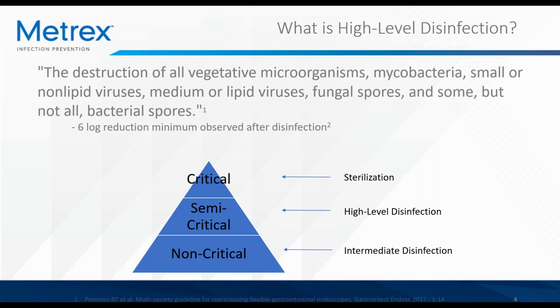The focus of today's webinar is high-level disinfection, which again is defined as the destruction of all microbial life with the exception of some bacterial spores.